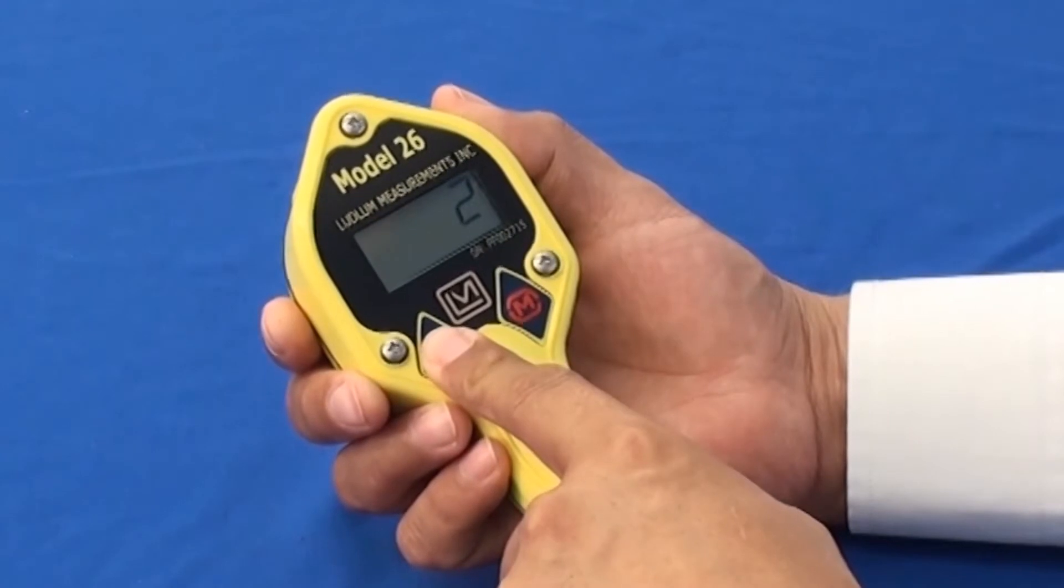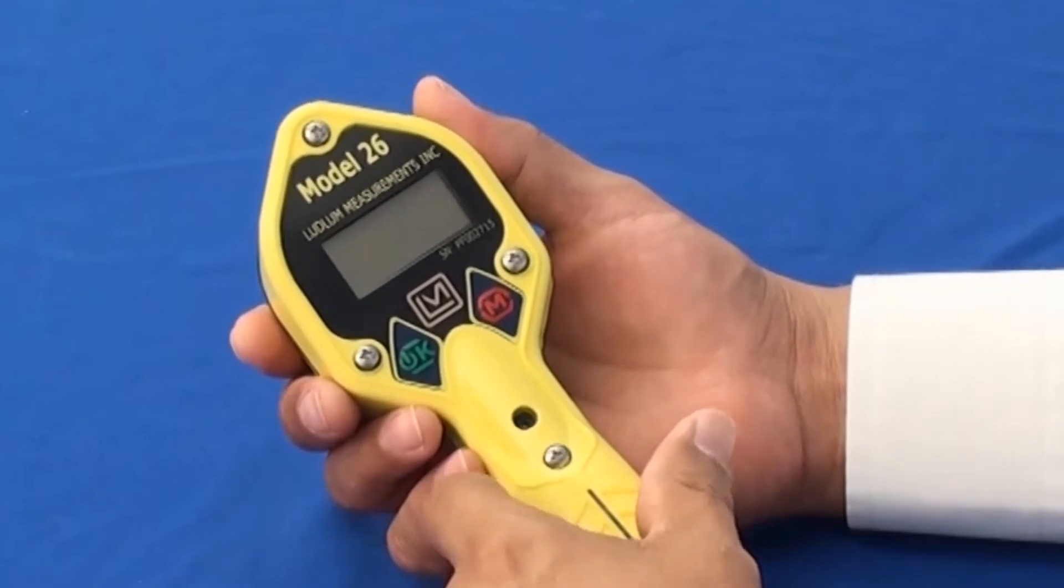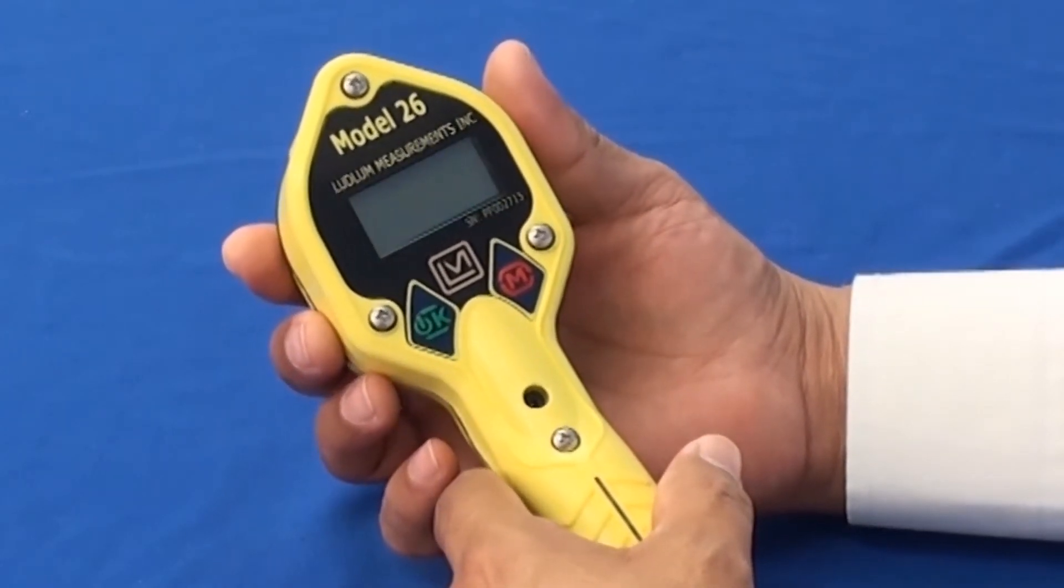Upon power down, you'll notice the display counts down for three seconds, at which point you'll release the power button and now you've turned the model 26 off.